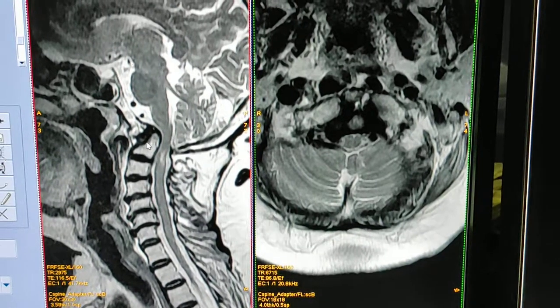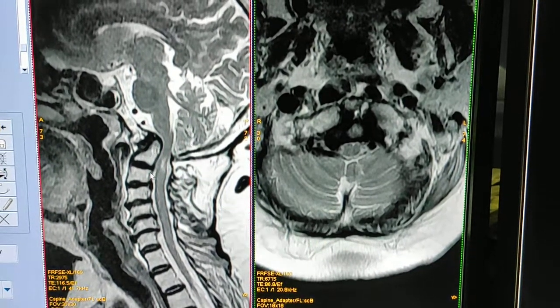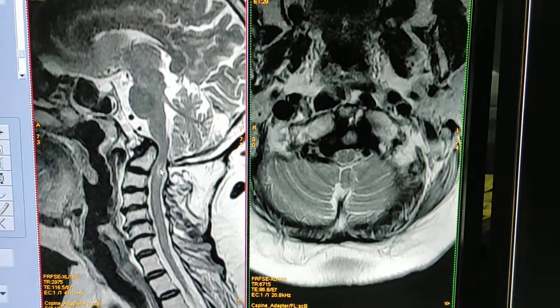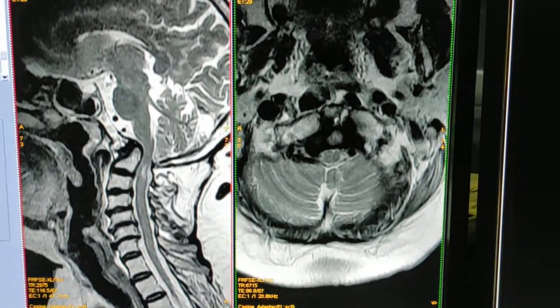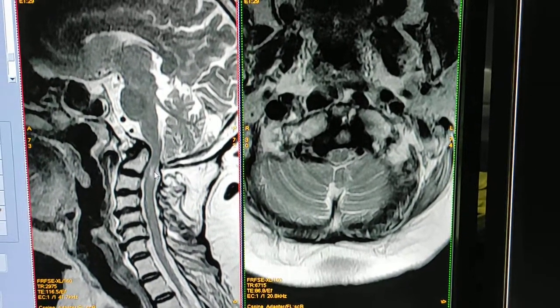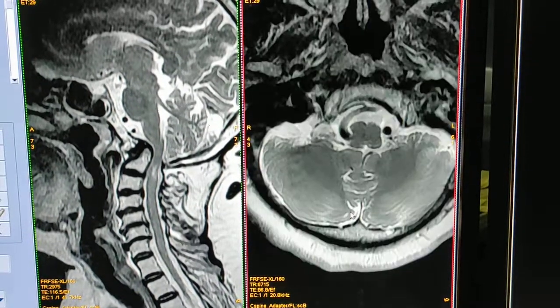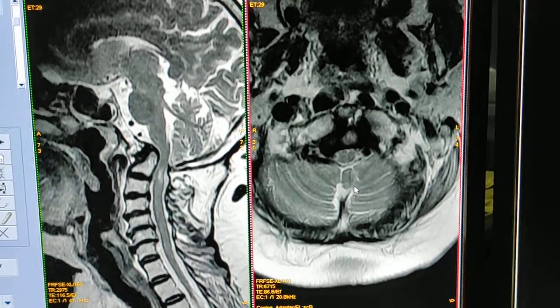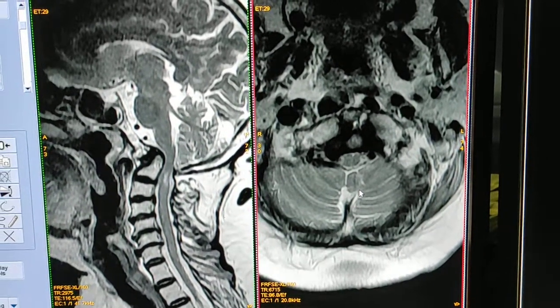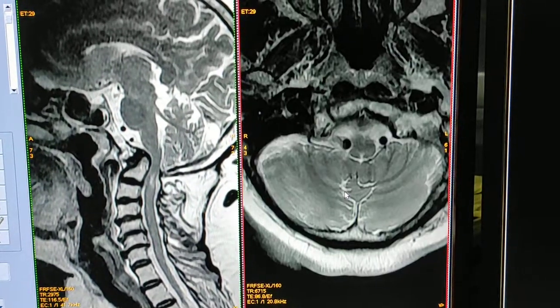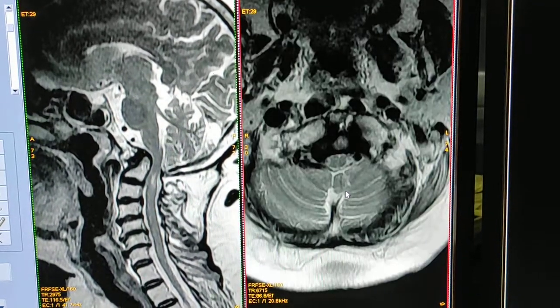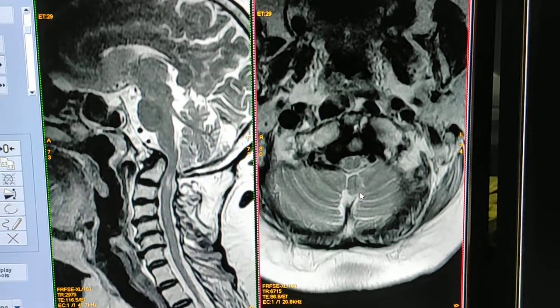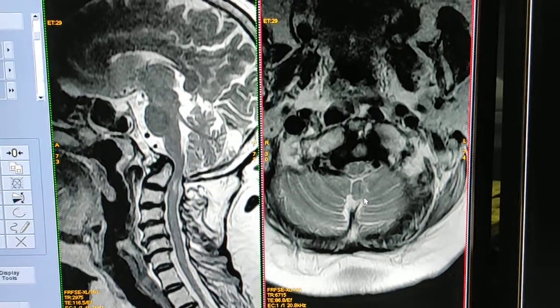You can see this CV junction. Here is the signal — T2 weighted hyperintense signal in the spinal cord. This is axial T2 weighted. The dens is also directed posteriorly. There is mild basilar invagination and narrowing at the craniocervical region.